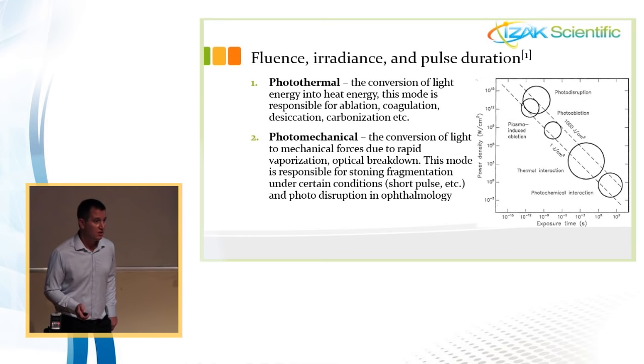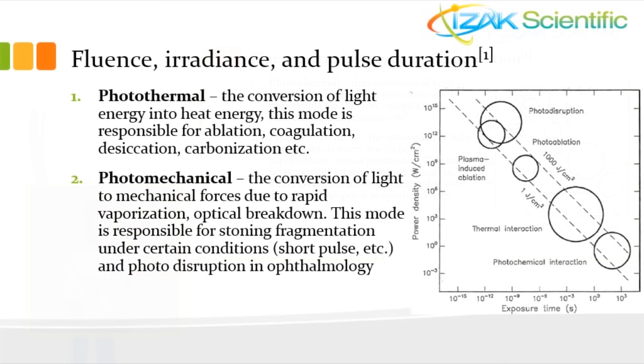For example, if we use a very short pulse width inside water, a bubble comes and then the bubble collapses, and there is an optical breakdown. Then there is a mechanical force, like a shock wave, that comes to the tissue and makes damage. Assuming the same pulse energy, if one uses a long pulse width of tens to hundreds of microseconds, the interaction is photothermal and photomechanical. And if the pulse is shorter than microseconds, the interaction is only photomechanical.